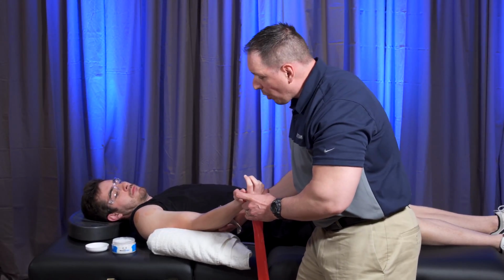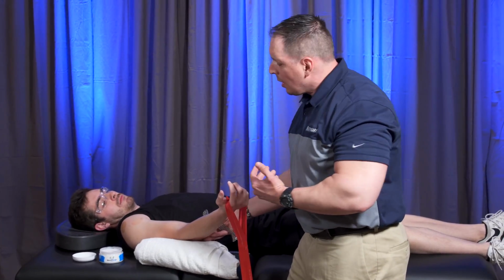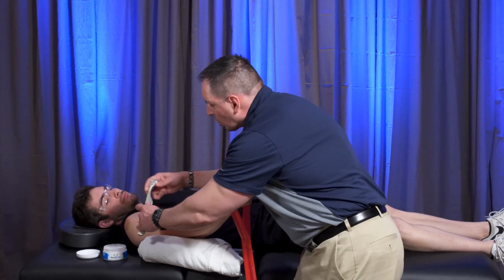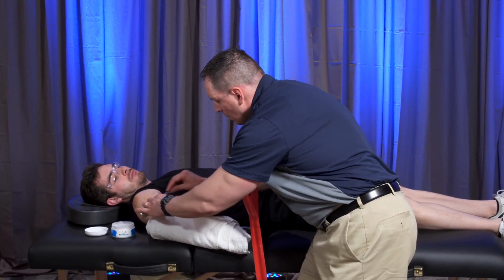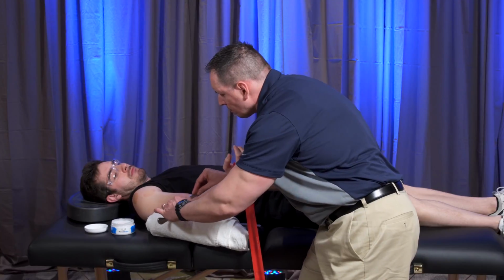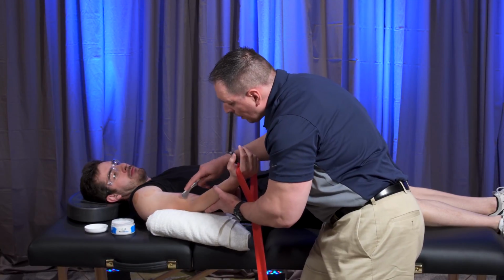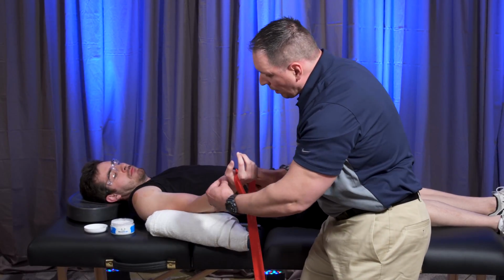So what I'll do now, we have our patient positioned comfortably, and we position ourselves for success at the same time as we want to make sure to introduce this technique slowly. So I'll come along here, and I'm going to start to do a nice slow sweep and scan of that particular area. I could work down here into the antecubital fossa. I can use my hook to get in under that bicep tendon, either laterally or medially. And then I can work with this instrument right up into the forearm.